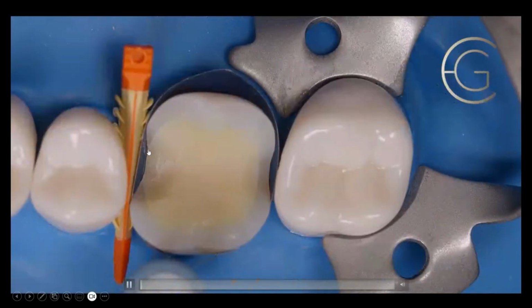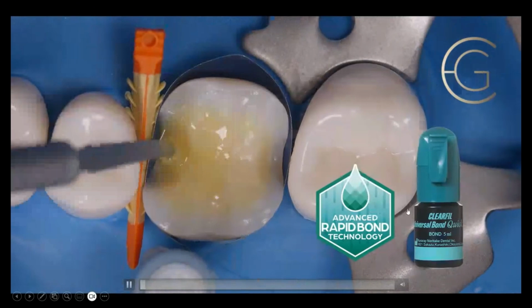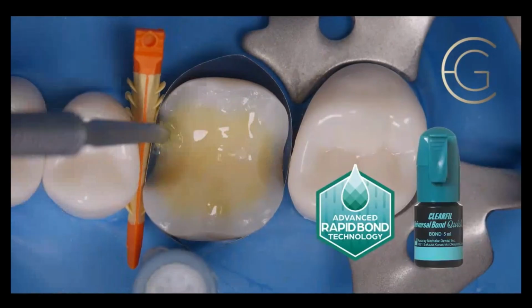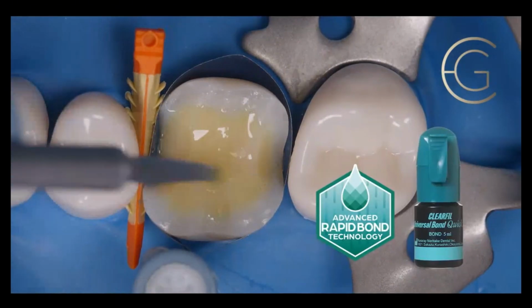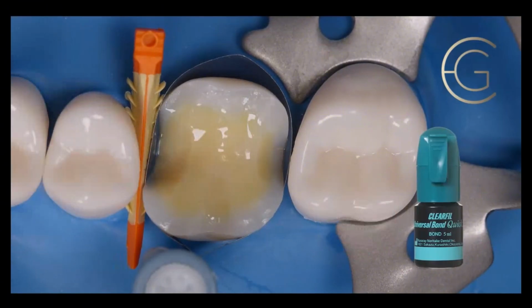10:38. So this is a bilaminar tooth that I did, and you've got the band of enamel here. You're seeing this. I'm applying Universal Bond Quick. Remember the 3 monomers we were talking about that are on here? The moment this touches the tooth, it has advanced. It's done. You don't have to keep scrubbing this in for 10 or 15 seconds like other products.